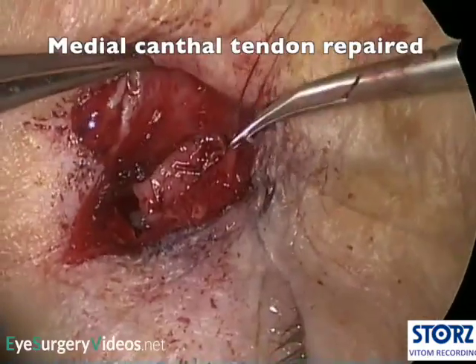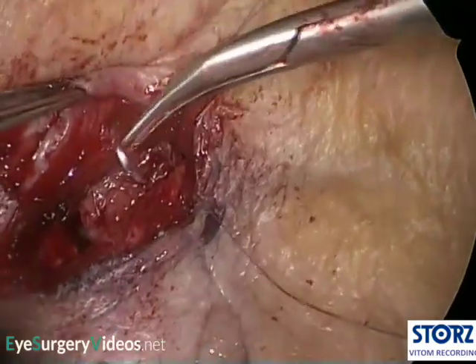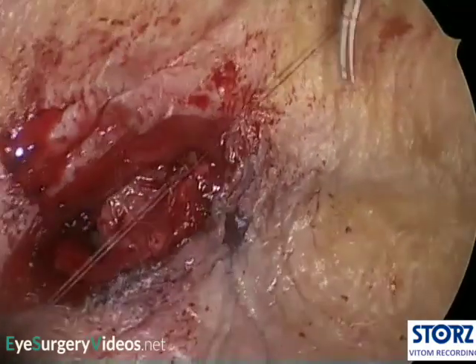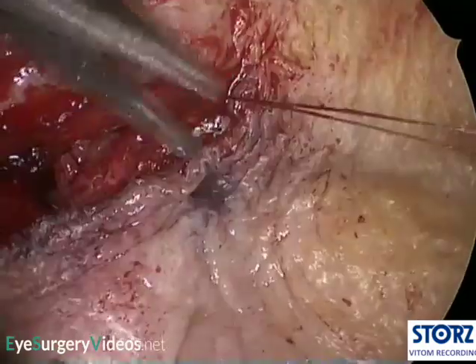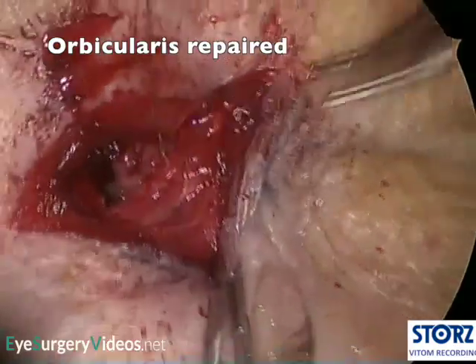Surgeons vary in how they close the DCR incision. This video demonstrates reattachment of the medial canthal tendon and closure of orbicularis, followed by a continuous suture to close the skin. Some surgeons, however, just close the skin.